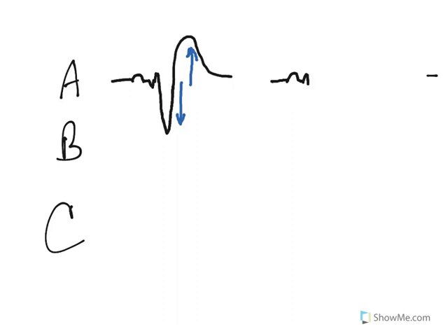So we got it like this, and then we notice that we've got this sort of, that's not going to work. Hold on, let me clear that one out. Let me draw it the way I know to draw it. That'll work better. So we kind of go here, and then we see maybe a QRS that's going up in this direction, and then we see this. So we have still a weird bundle branch, and again, this is no longer lead V1.